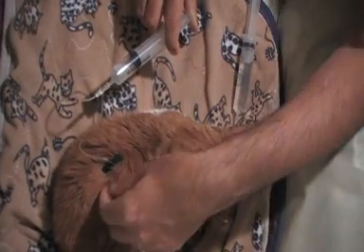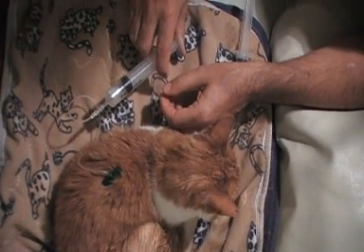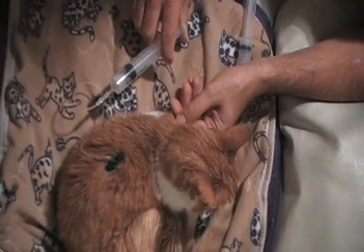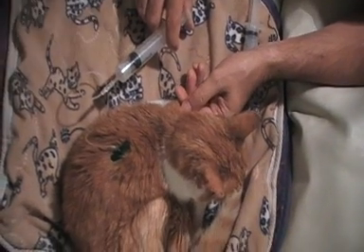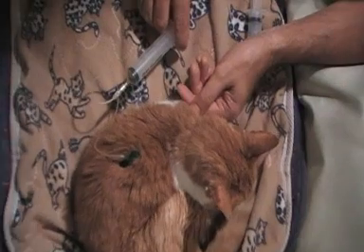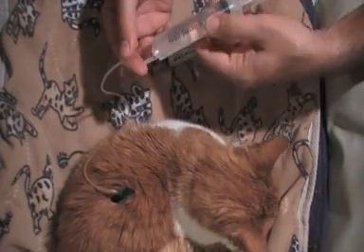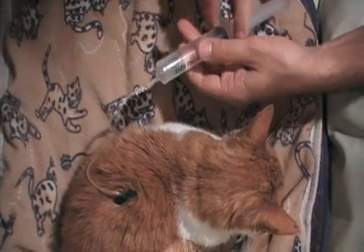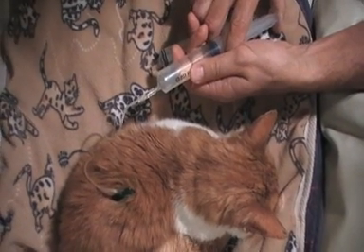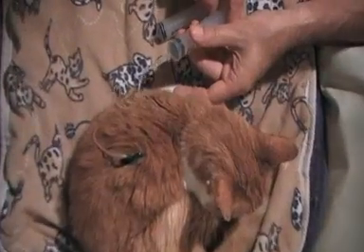You can see the ball rising underneath the skin, which is quite normal. This will dissipate with time. Nothing unusual about the ball forming there. That's one of the 30ml syringes done. Put the other one in — easy transition, no time at all. Away we go again.